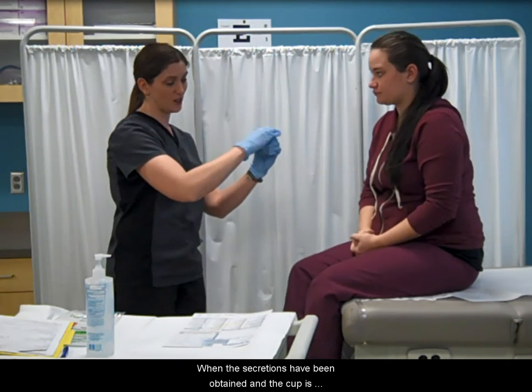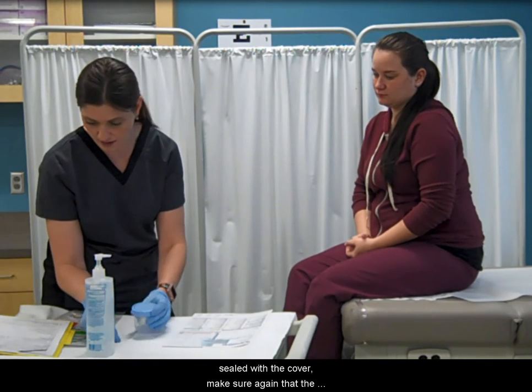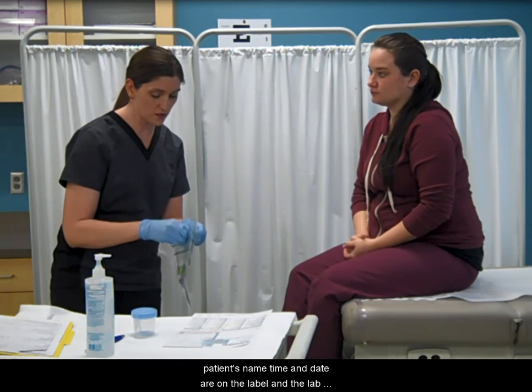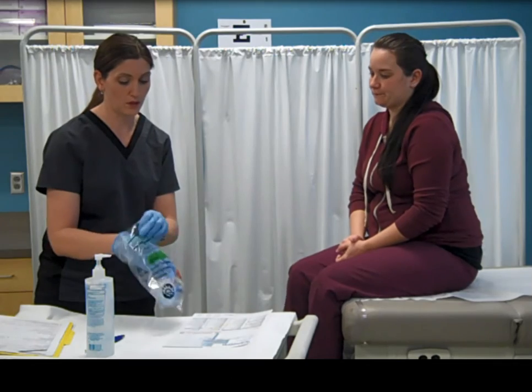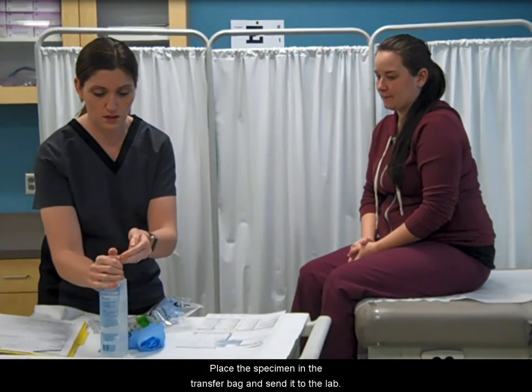When the secretions have been obtained and the cup is sealed with the cover, make sure again that the patient's name, time, and date are on the label, and the lab request form is ready. Place the specimen in the transfer bag and send it to the lab.